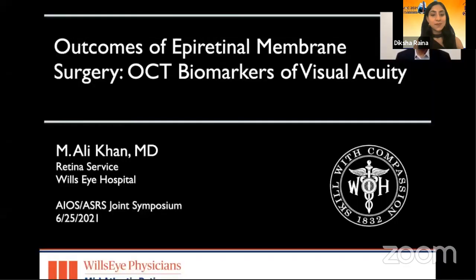Good morning, everyone. My name is Ali Khan. I'm a member of the Retina Service at Wills Eye Hospital, and I'm happy to present to you this morning regarding outcomes of epiretinal membrane surgery and OCT biomarkers of visual acuity.